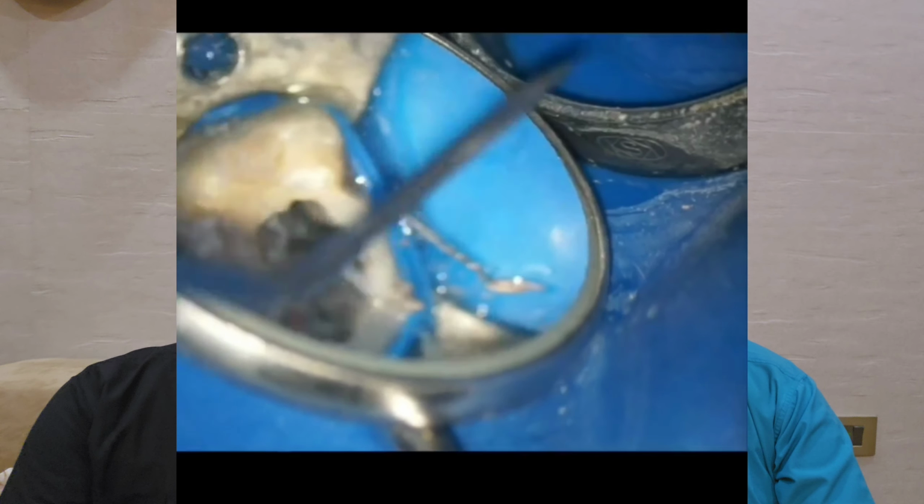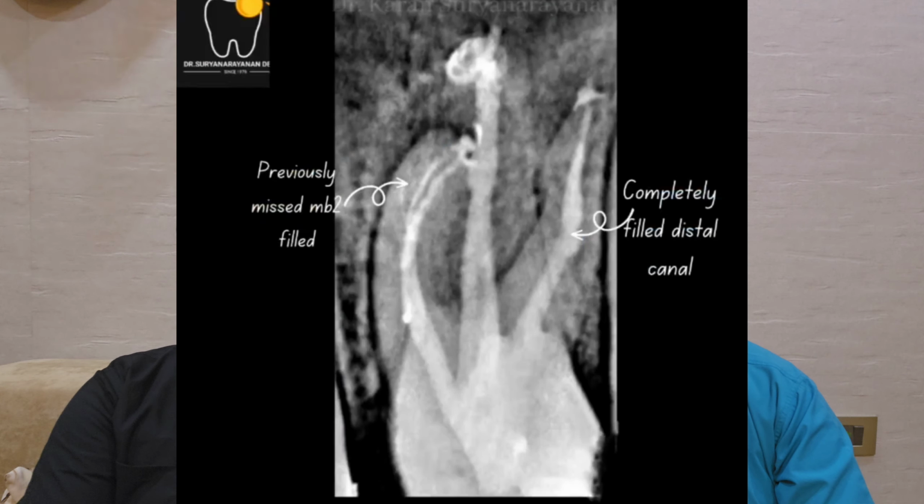In the first two instances, it becomes a little unmanageable because it's a liquid and it flows anywhere. This is a very manageable complication, but only if the operator has the equipment and the technique to manage it, or refers it to a specialist to remove it. Like we remove a lot of files underneath the microscope, but that again is a costly procedure, and generally people like to keep the bills of the patient low, and that is why they don't want to refer them, and wait for it to get severe and complicated, and then it becomes again a massive complication.